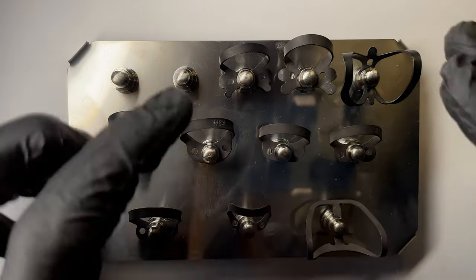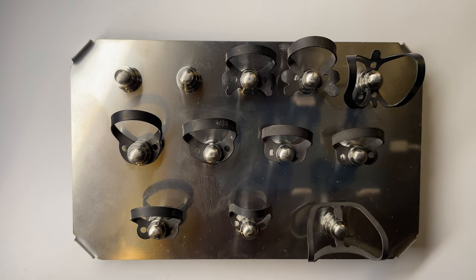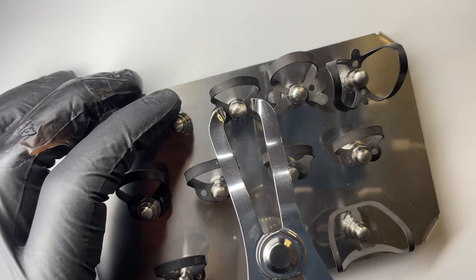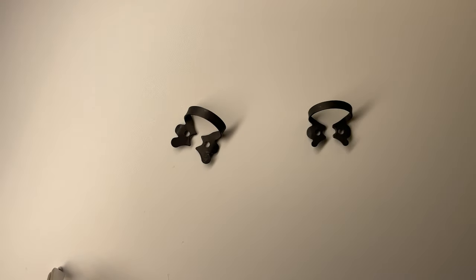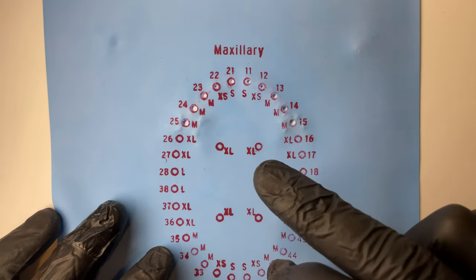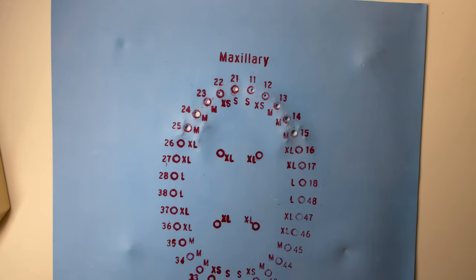I like to use winged clamps for my premolars generally — I find them just as easy as a wingless. We do have a W2 wingless as well, but I prefer the winged ones. I find the wing technique very easy for anterior sextants. So you've got the 2 and the 2A — the 2 is just slightly smaller than the 2A. You'll probably use the 2 slightly more. I've punched the holes from 25 to 15, though I often just go 4 to 4.